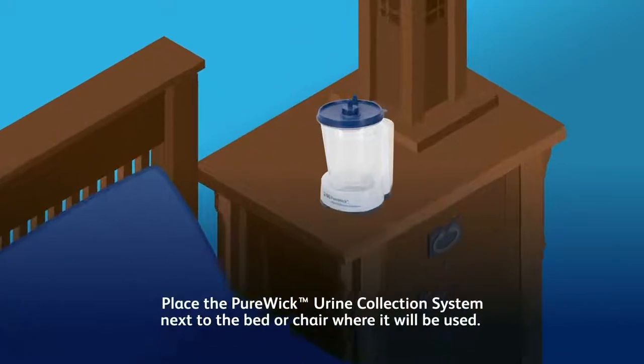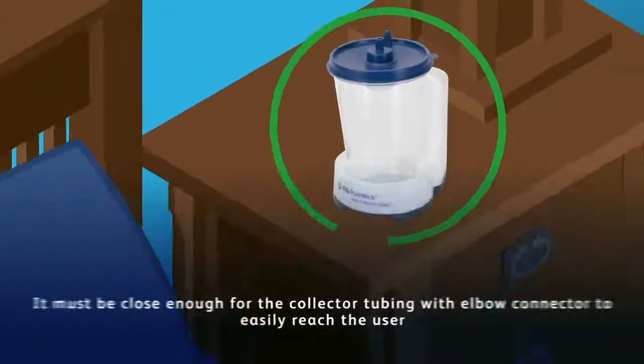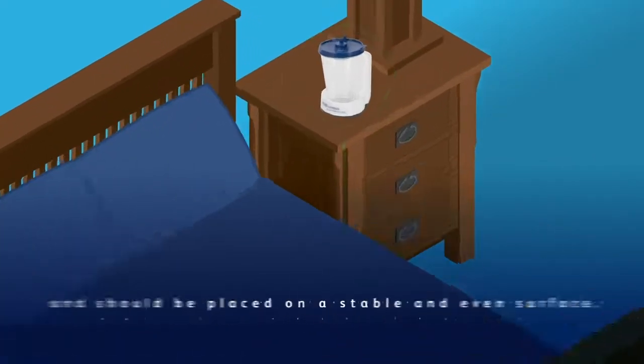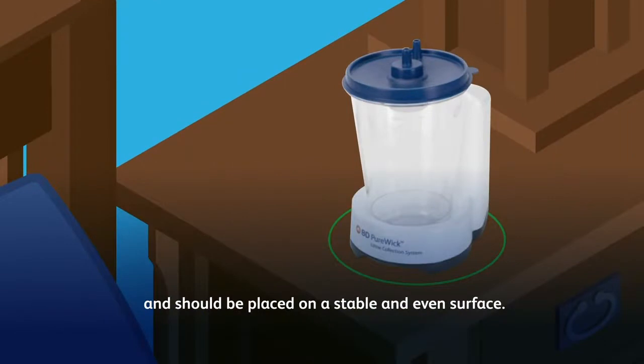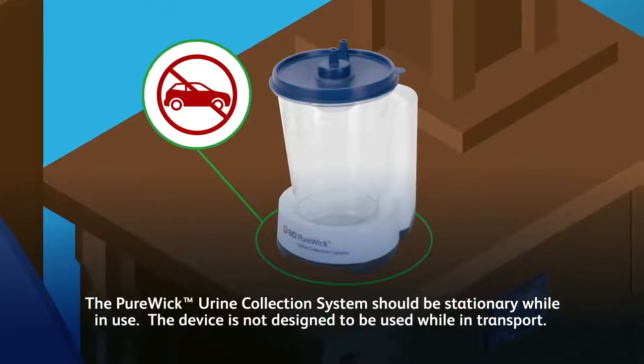Place the Purewick Urine Collection System next to the bed or chair where it will be used. It must be close enough for the collector tubing with elbow connector to easily reach the user, and should be placed on a stable and even surface.